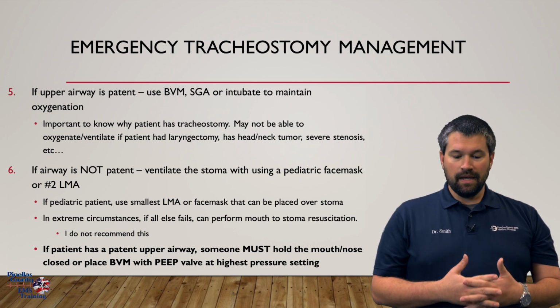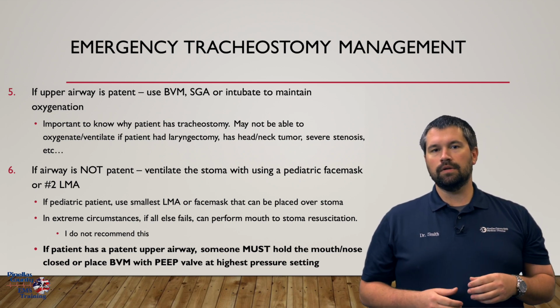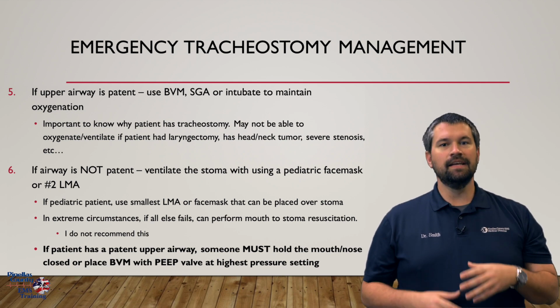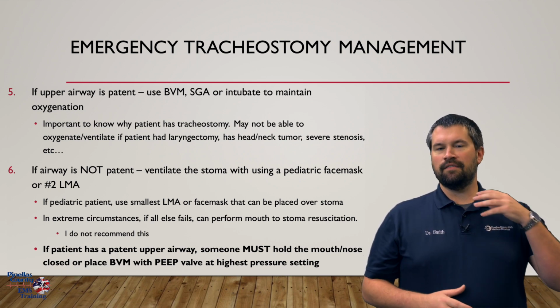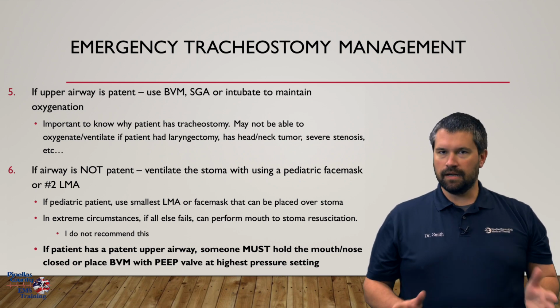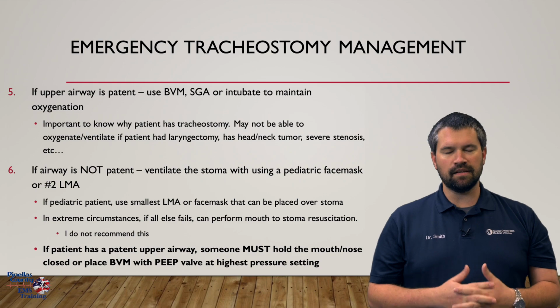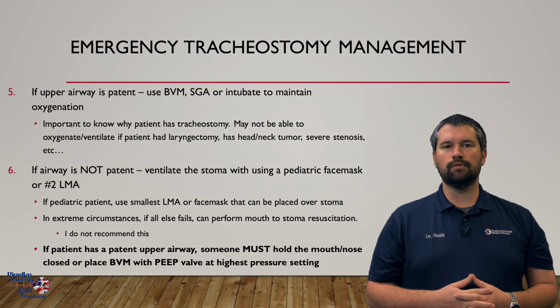If a patient has a patent upper airway, you must hold the mouth and nose closed in order to bag over the stoma. Remember that. Otherwise, you have air going down the lungs and out the mouth. You're not going to get the pressures you need. Also use the highest pressure settings you can set on your bag and use a PEEP valve if available.